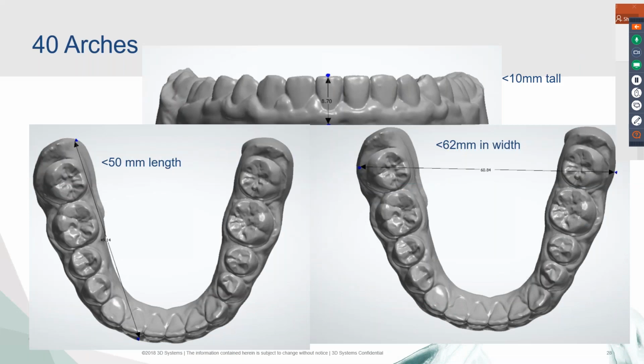Now, you want to fit the max number of arches on your build platform. There are certain standards that you can work with your technicians on and say, hey, keep these around this tall if you can. You'll start being able to eyeball them, really. A lot of the beta testers so far can tell exactly how many arches are going to fit. They'll bring in a certain number of sizes. You can see it in the pan if you're looking at impressions. It really depends, but you get really good at being able to cram as many as possible onto that plate.